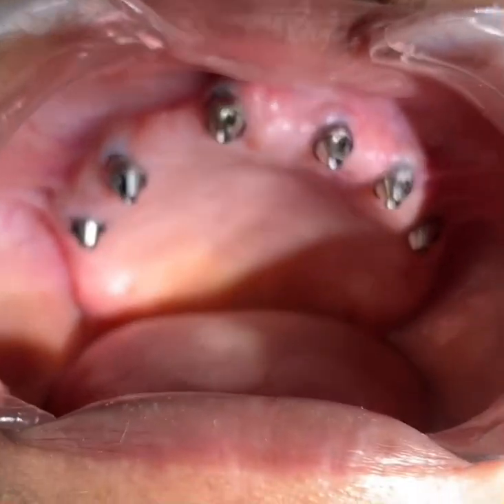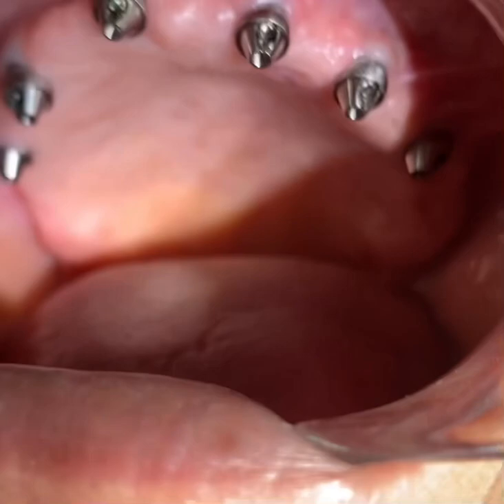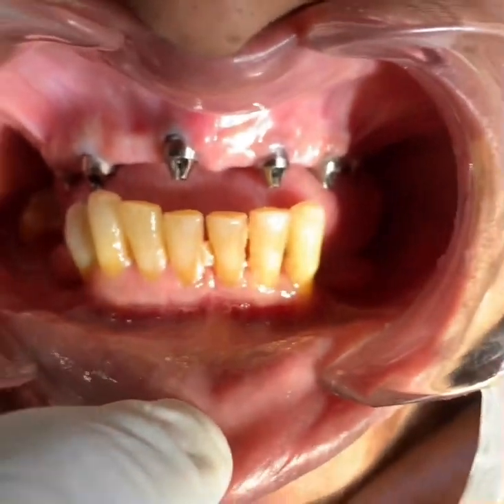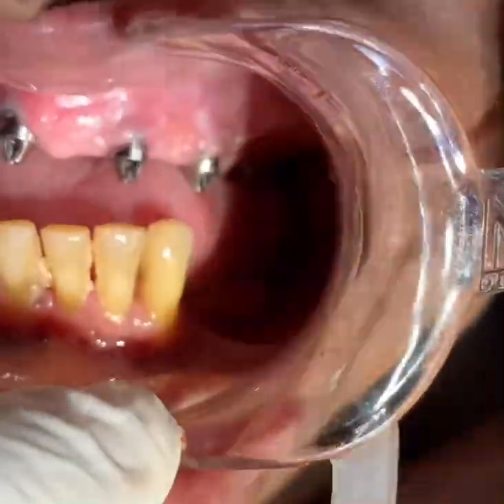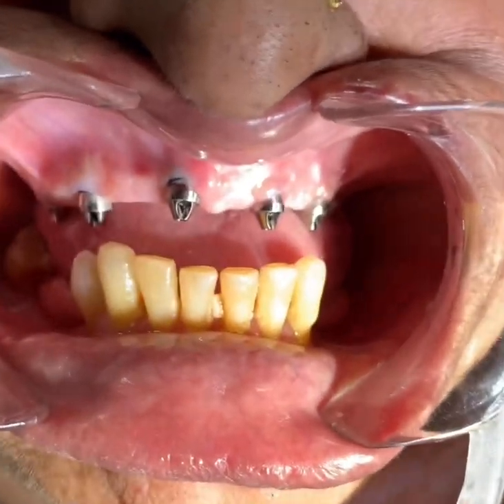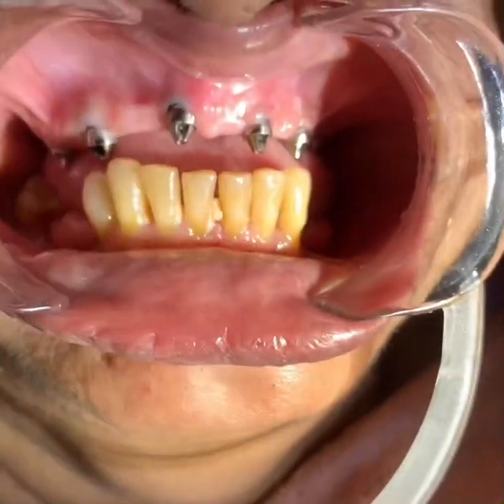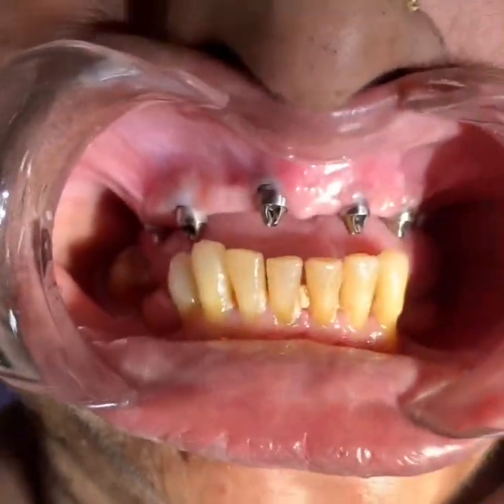We have placed six implants in the upper arch with multi-unit abutments onto those six implants. The lower anterior is present with just one molar at the back on the right side and none on the left — a cast partial denture will be planned later. This is typical of a combination syndrome scenario, whereby the maxillary anterior might become a flabby ridge if not restored with either a complete denture or an implant-supported prosthesis.